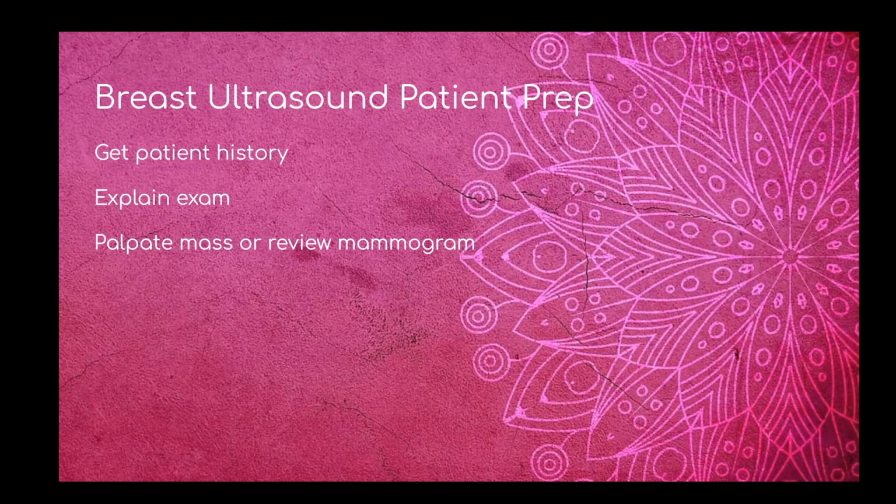You also then want to make sure that you are palpating any masses that they are feeling, making sure that you are feeling the same thing they are. I had a patient that had a palpable mass, and that's the reason she was coming in. When I got her on the table, she couldn't find it. And so she was feeling all over, and then she's like, okay, no, here it is. And she's like, oh, but it kind of feels like it's up here.